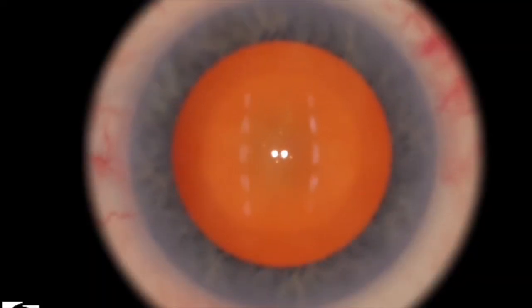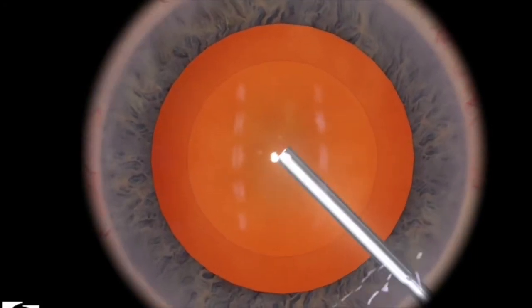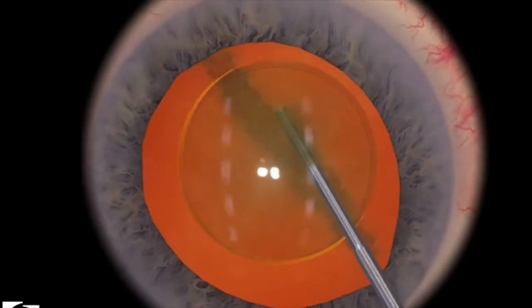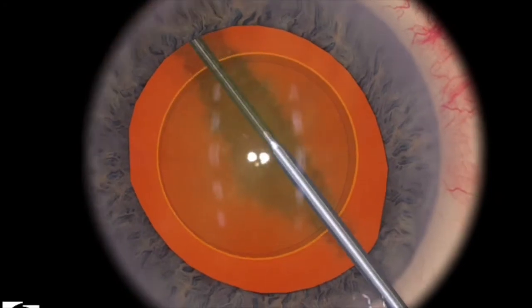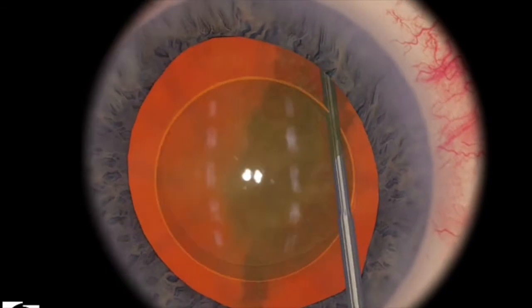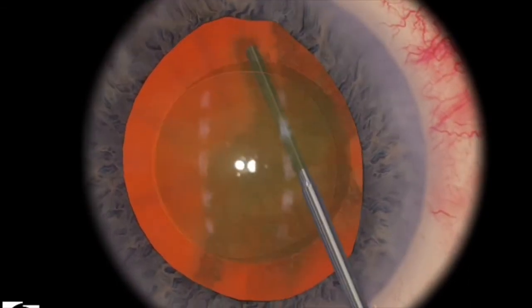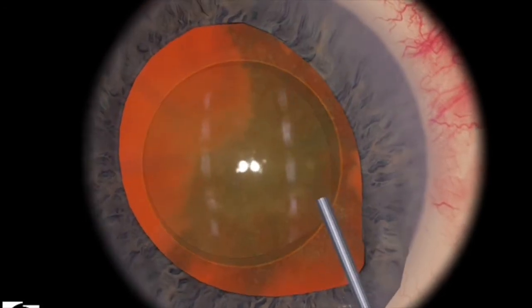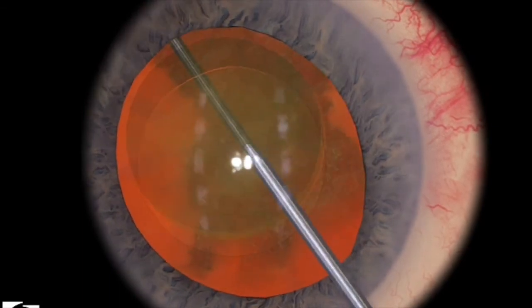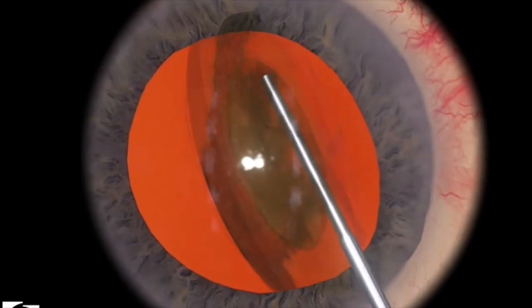Let's take a look at some things that you shouldn't do in this particular exercise. Here I've entered and hydro delineated, but I'm putting a lot of pressure — I'm injecting at a very fast rate. Eventually you can see that the iris is starting to prolapse a little bit, and things are starting to come forward as well. If you're injecting too much without control, something pretty spectacular but pretty bad will happen — the zonular attachments have completely broken off.